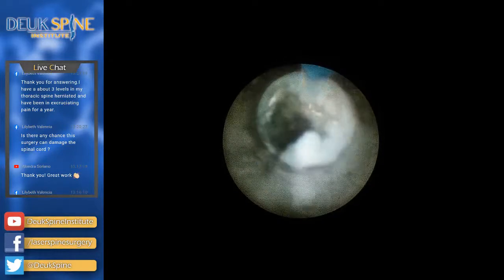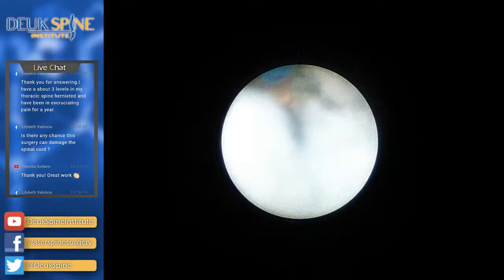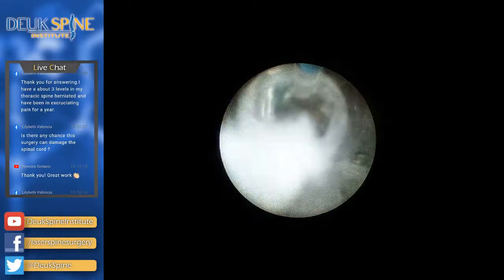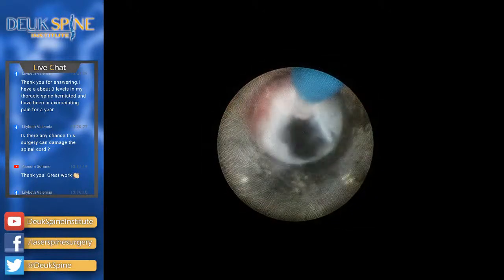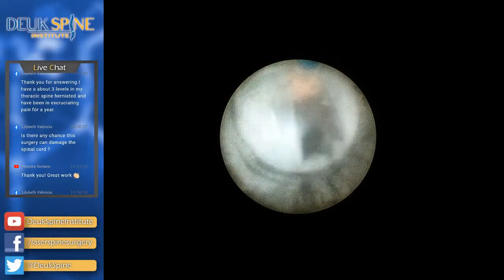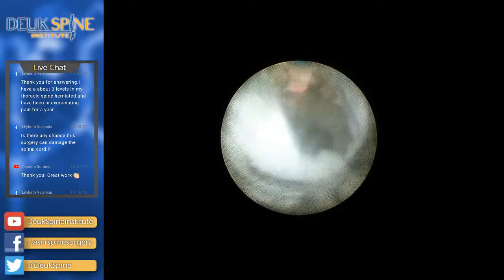Yeah, debulking. Now, the more I can get out, the better for the patient. You are correct. Yeah, well, he wanted both sides done, and he's an engineer. He's a pretty smart guy, so he knows what he wants. Yeah, of course. Who am I to argue with my patients, you know?